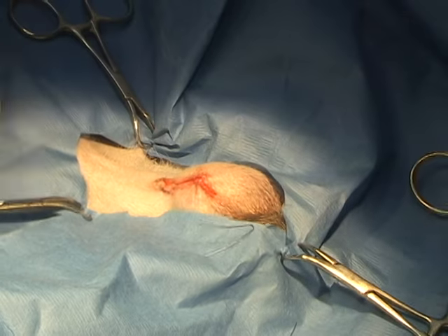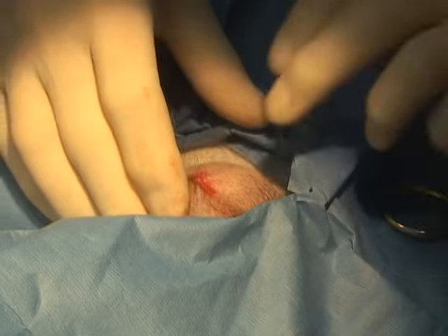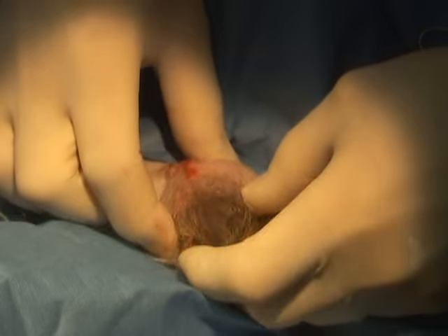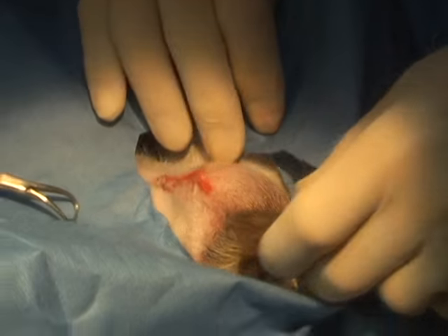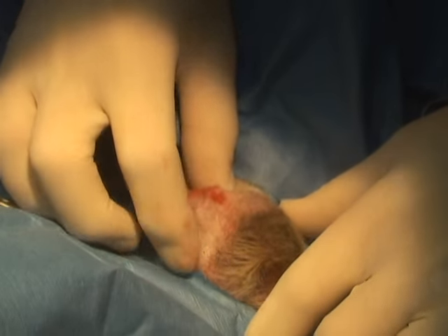Very normal looking scrotum postoperatively. Once the testicles are pushed down about where they belong, it looks like he should get some more stretching in the scrotum to accommodate the two testicles after a couple of weeks.